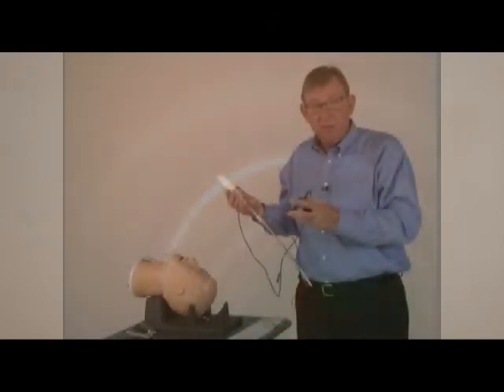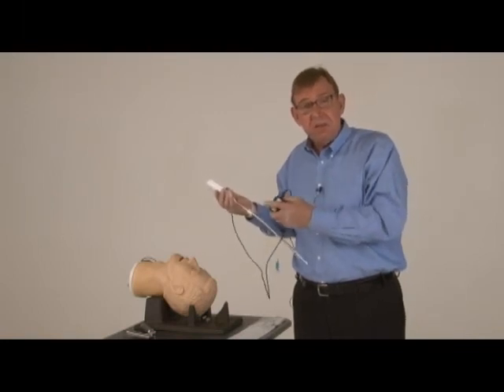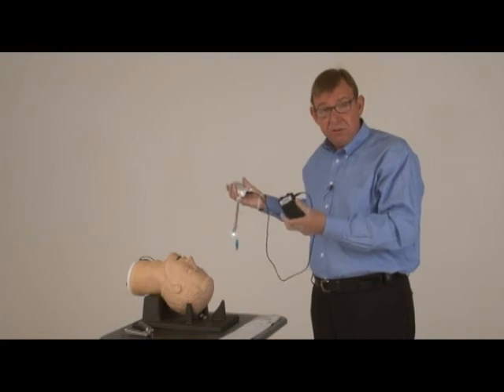If you forget, it'll automatically shut off in two minutes. What many EMS providers are really excited about is the ability to take a JPEG still image of the tube lodged inside the trachea to make it part of their electronic patient record. That's the PIC-STICK DVR for ViewStick.